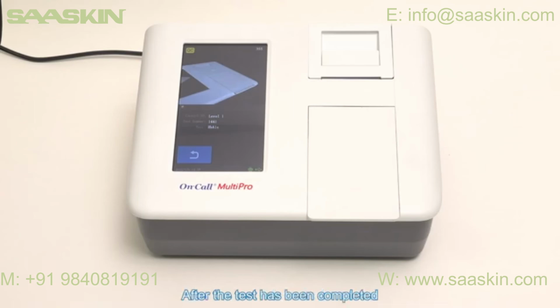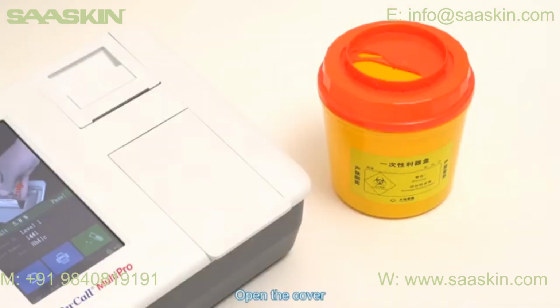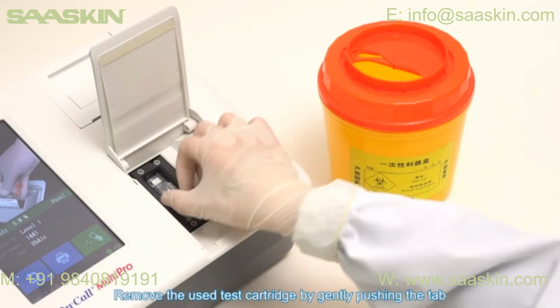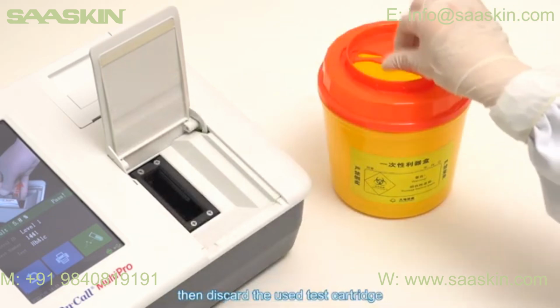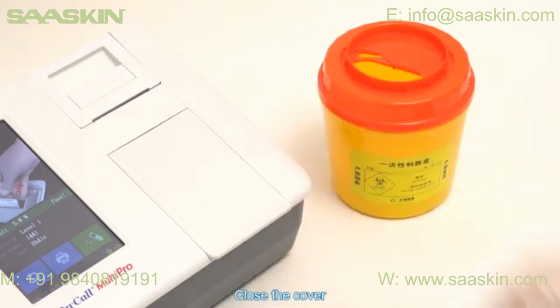After the test has been completed, the result will be displayed on the screen. Open the cover. Remove the used test cartridge by gently pushing the tab on the top of the cartridge to the right. Then discard the used test cartridge. Close the cover.